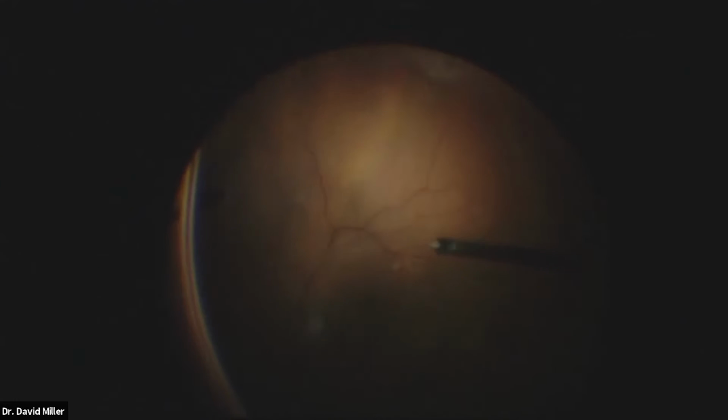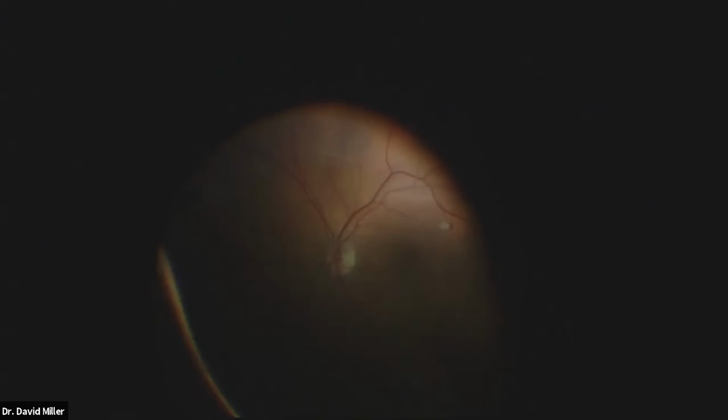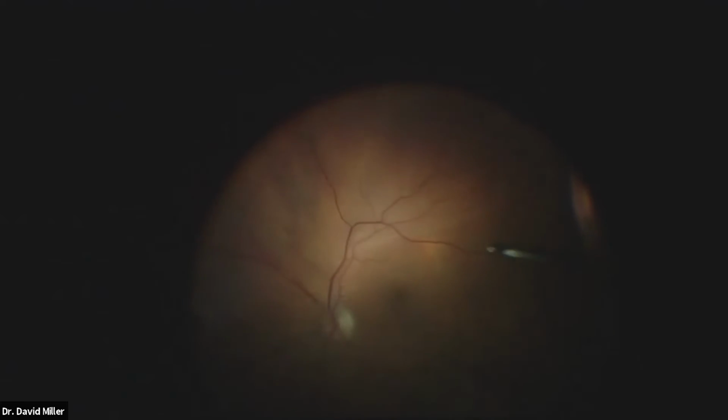Okay. You can see the bubble in the eye still. We're going to grab some of that. Some of it already came out. There we go. We just remove the bubble. Don't have to get all of it, just enough so it's not interfering. You see some of the debris flying around from the prior surgery.